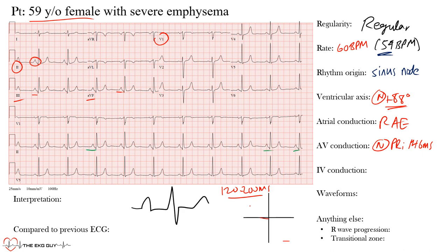Next is intraventricular (IV) conduction, assessed by the QRS duration. The PR interval runs from the start of the P-wave to the start of the QRS, including the P-wave and PR segment. The QRS duration runs from the beginning to the end of the QRS complex. Normal QRS duration is less than 120 ms (typically 70–110 ms). In this case, the QRS duration was 90 ms — within normal limits — so intraventricular conduction is normal.